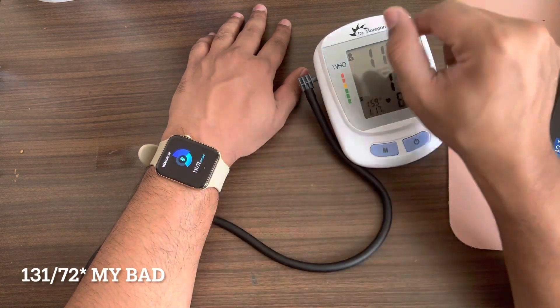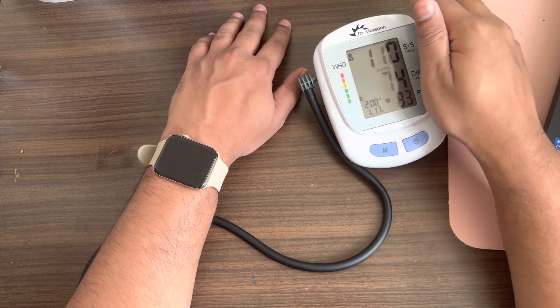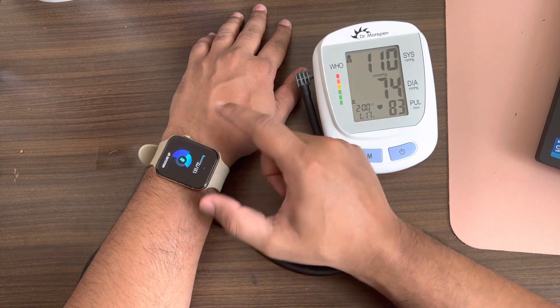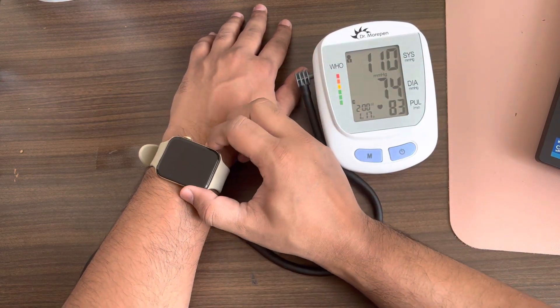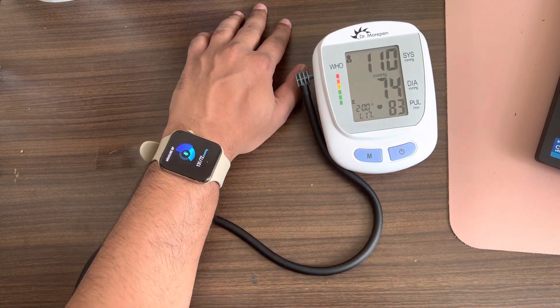That's very far from what the monitor shows — I'm not sure which is accurate, but the discrepancy is significant. Maybe there was some interference because of the cuff since we were doing it simultaneously. So let me do it separately now and see how it turns out. Let me remove the cuff.